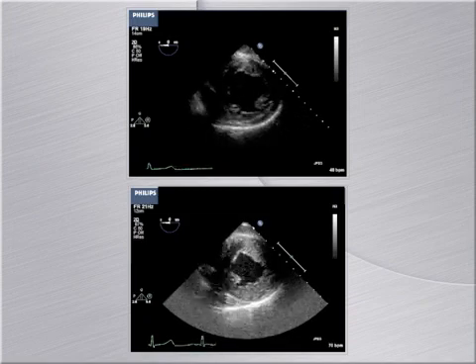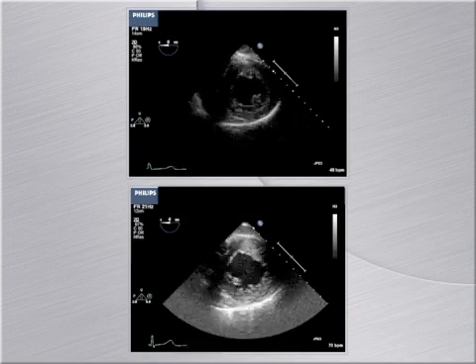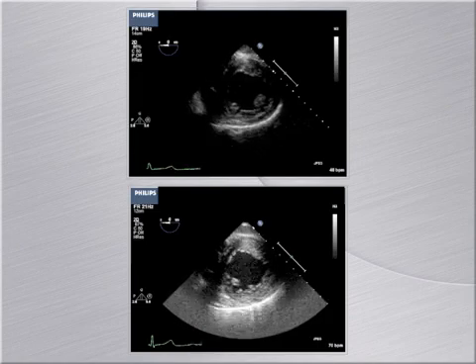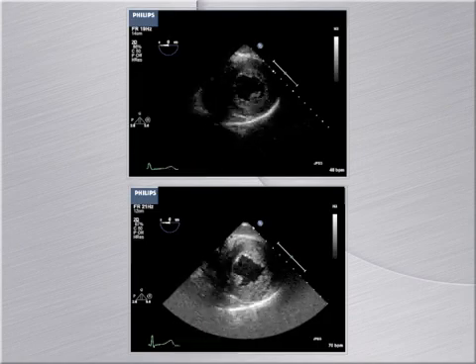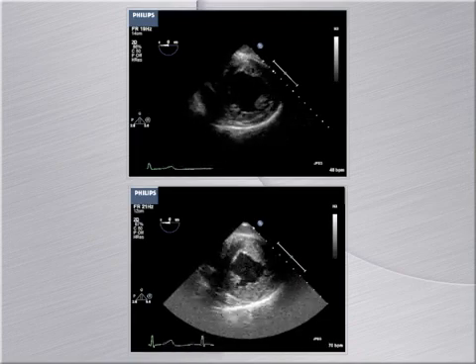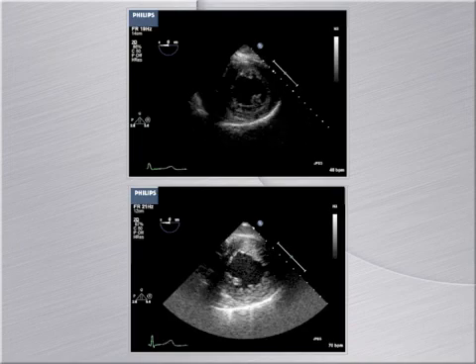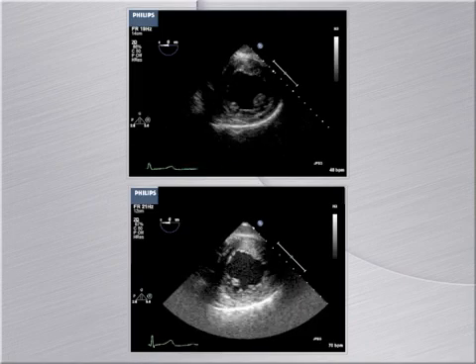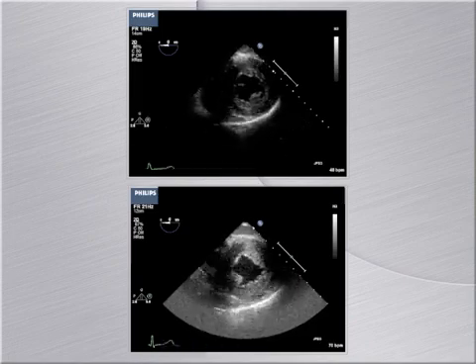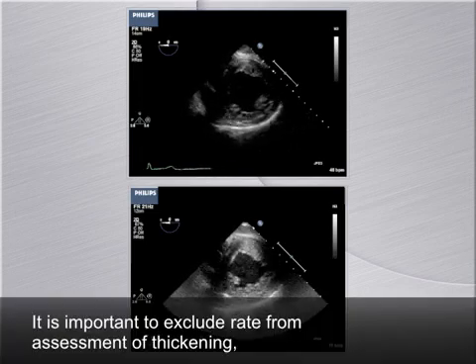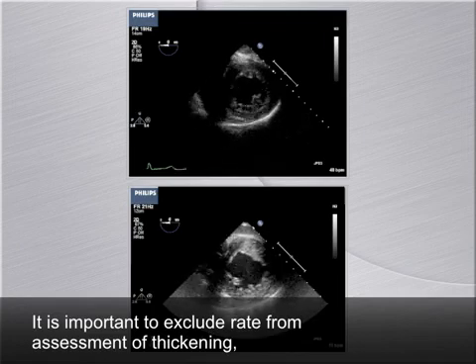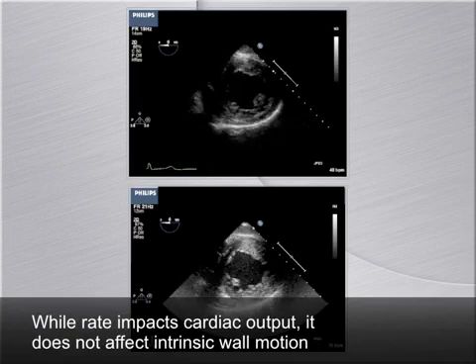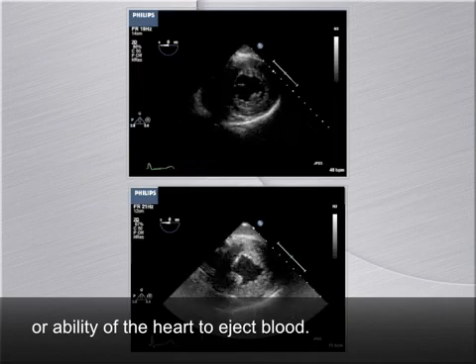These images both illustrate normal LV systolic function with normal wall motion and an ejection fraction visually estimated at greater than 55%. The slower heart rate in one image may lead to a false sense that it is less contractile. It is important to exclude rate from the assessment of thickening, contractility, and motion. While rate impacts cardiac output, it does not affect intrinsic wall motion or the ability of the heart to eject blood.